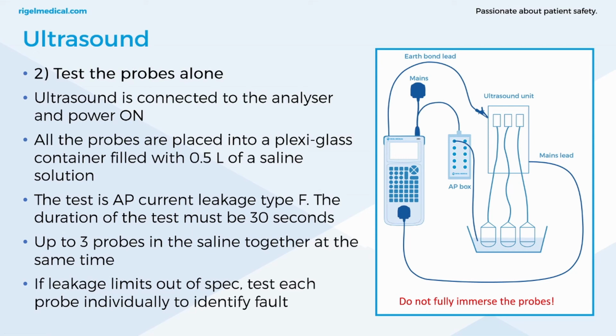So yeah, I have to just reiterate that these methods come from manufacturers of ultrasound equipment, but just remember that this stems from the IEC 60601 standard, which we check. So there are sections in this standard that state to either use 0.9% saline solution, so that's 0.9% of saline in distilled water, or foil if an applied part appears to be fully insulated.